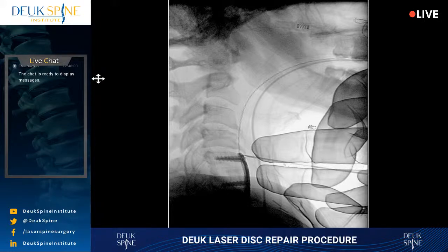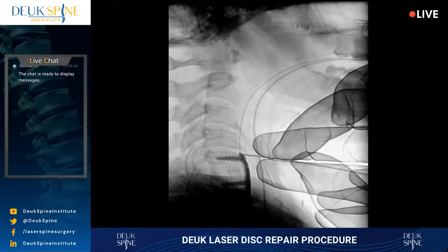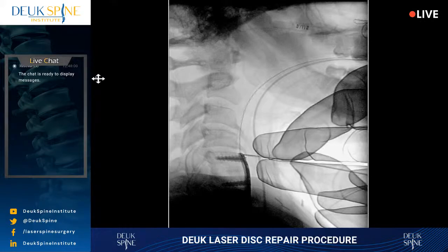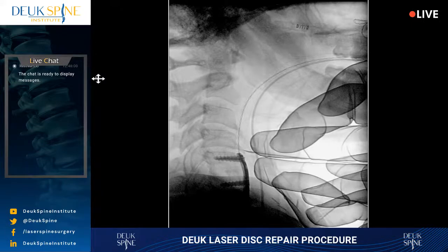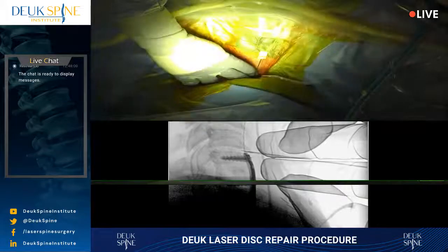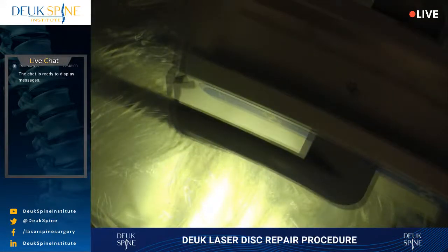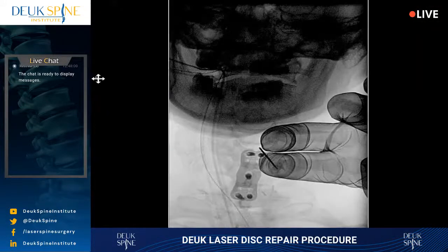Hold on. Just dealing with the top of the plate. Let's try, hold on. Let's try an AP now. Feels better. Let's see if it looks better. That looks better. All right.